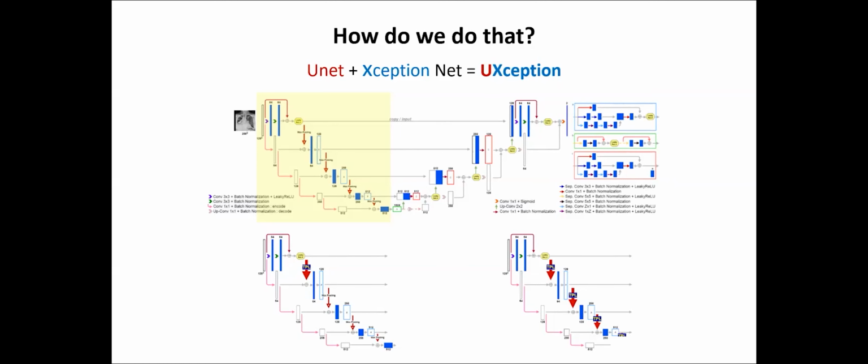It's interesting that this kind of model was originally used to detect glass cracking in glass factories in Italy. And it's very similar because the lesions of pneumothorax usually show sharp edges as well. So that's why we chose this model to help us.